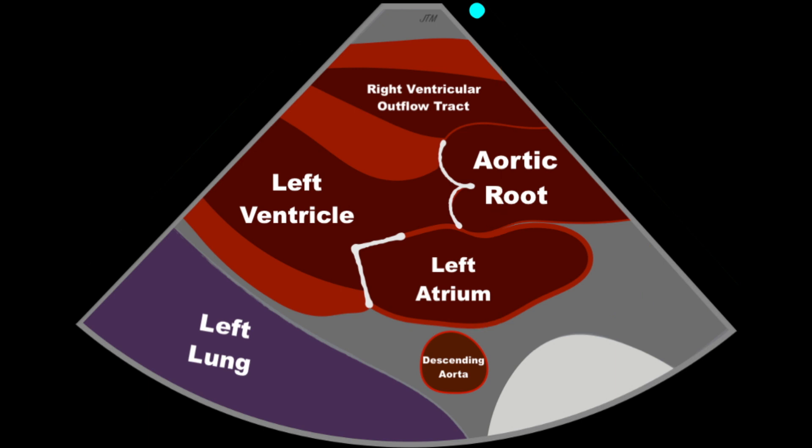If any of them appear enlarged or dilated compared to the others, that should raise concern about pathology that may be associated with that dilatation. We can easily see that when we take those markers off, each one of them should be about a third of the size of that base of the heart.